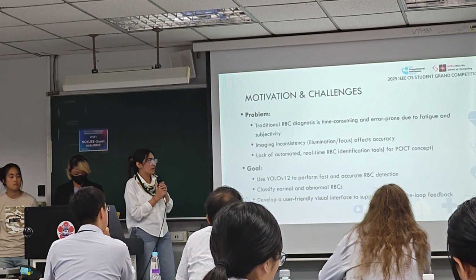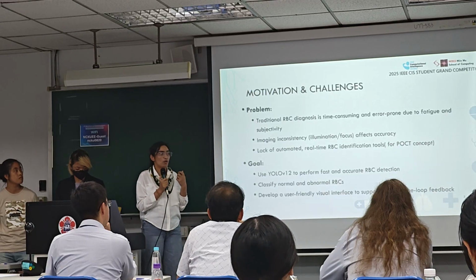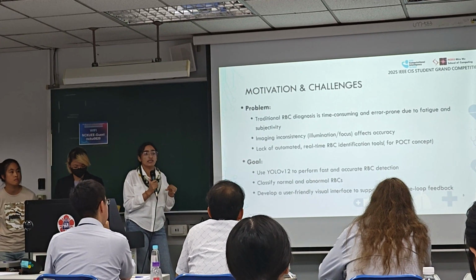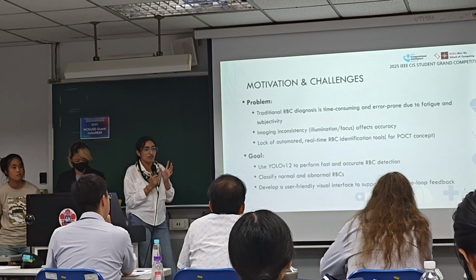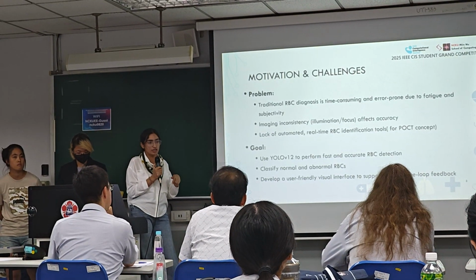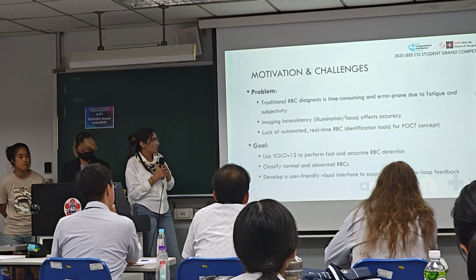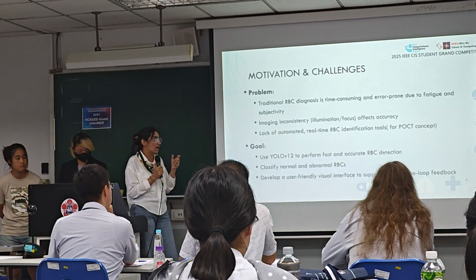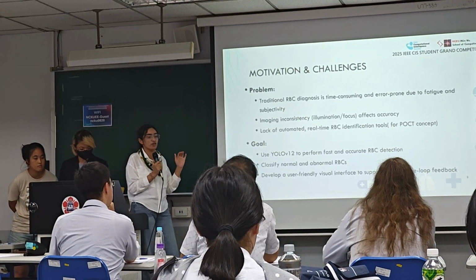Also, our idea for this project was to make this module and set up a system for real-time point of care testing and real-time evaluation. Although there are also automatic machines, our goal is to focus on POCT, point of care testing.